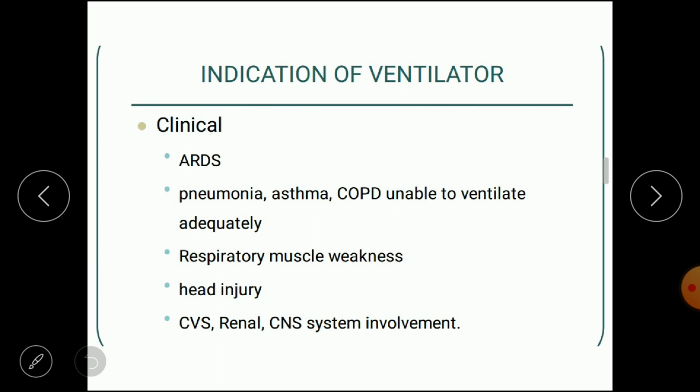In that, patients with ARDS, that is acute respiratory distress syndrome, require mechanical ventilation. The patient of pneumonia, asthma and COPD, okay, in these patients also mechanical ventilation is used. Pneumonia, asthma and COPD, that means chronic obstructive pulmonary disease, in these patients the mechanical ventilator is adequate.